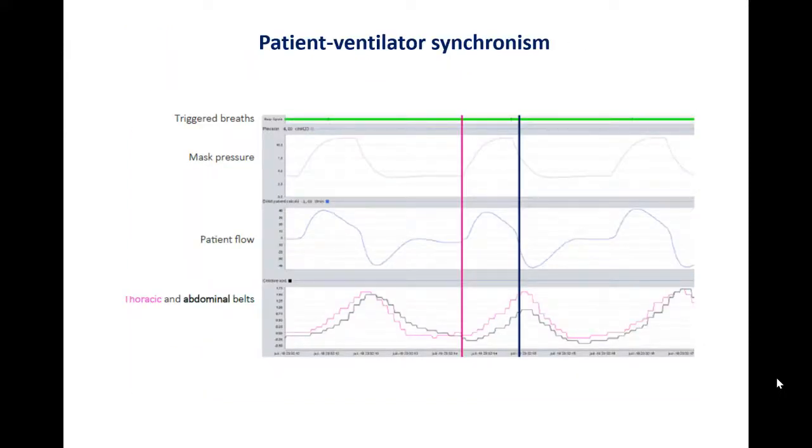What is very important with this integrated polygraphy from Breas is that we can also have an idea about patient ventilator asynchrony.